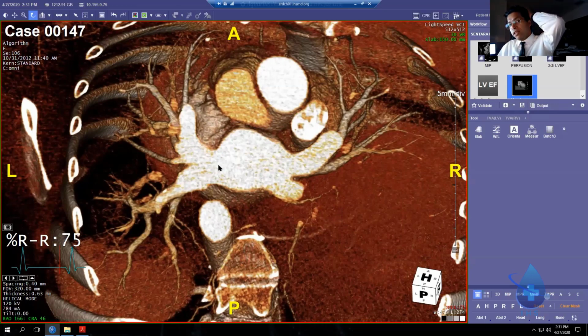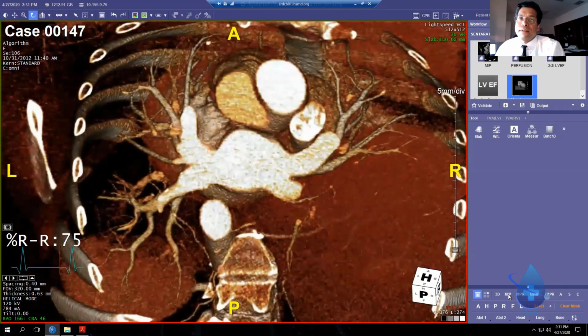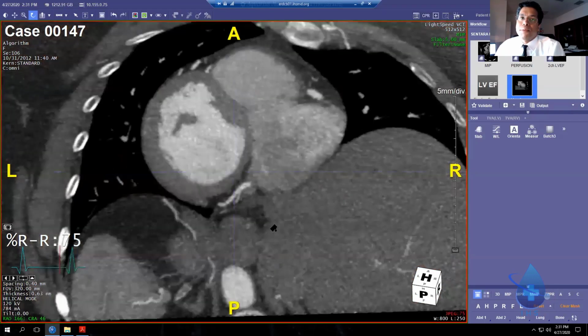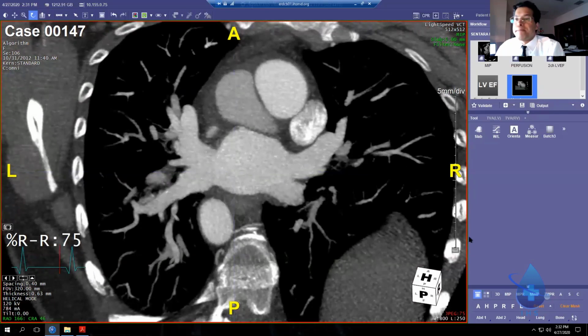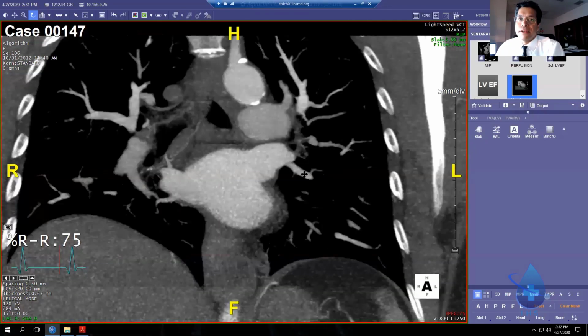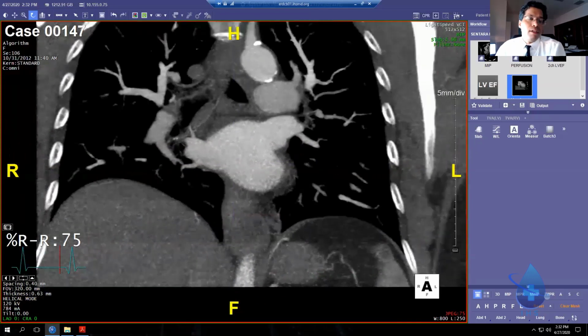The only thing that's as accurate as CT is ICE. And we're not going to go doing ICE just for veins. Okay, so that's how the pulmonary veins are evaluated. We're going to have a whole special lecture on those pulmonary veins later on Thursday, as we read for EP. So that's the pulmonary veins.